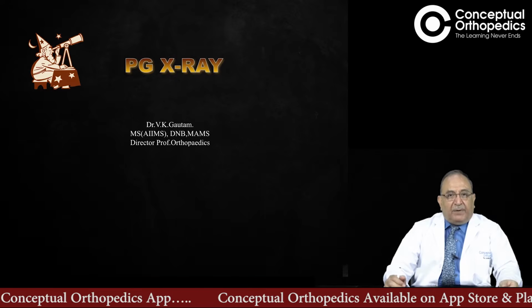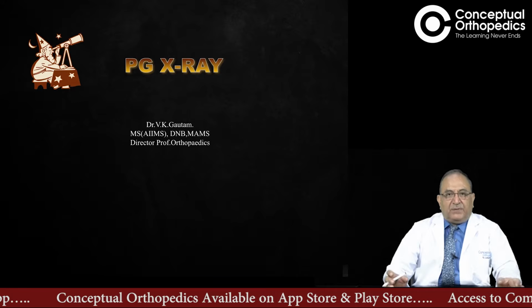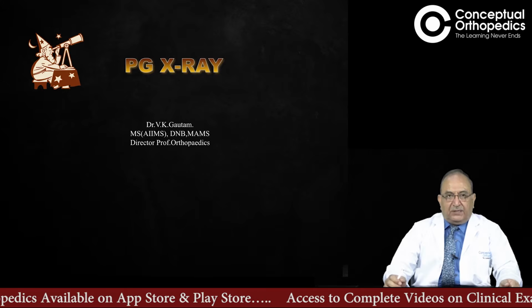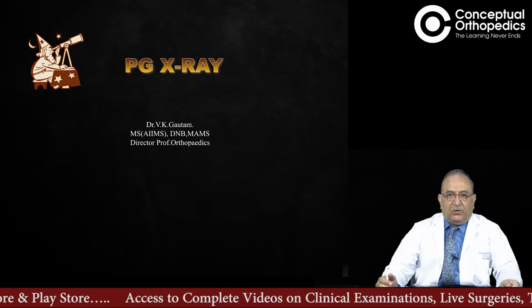So today I'll be taking a class on X-ray reading. Today's class is particularly meant for reading the X-rays related to bone and joint tumors. Subsequently, in further classes, I'll take other types of X-rays also.